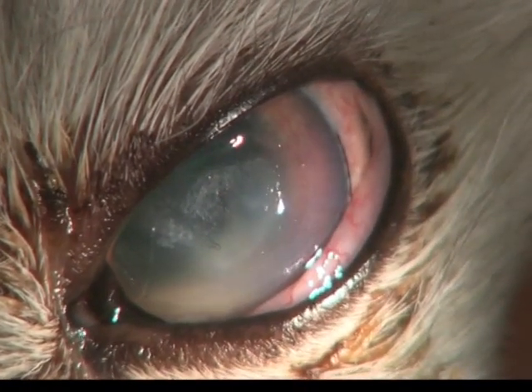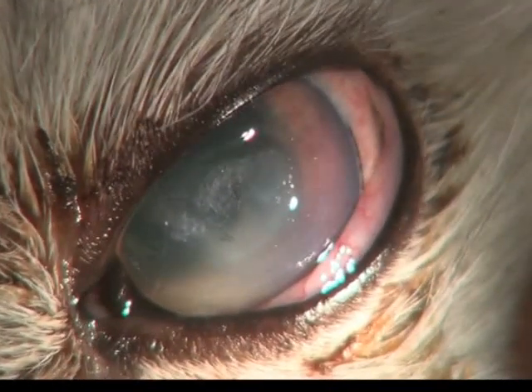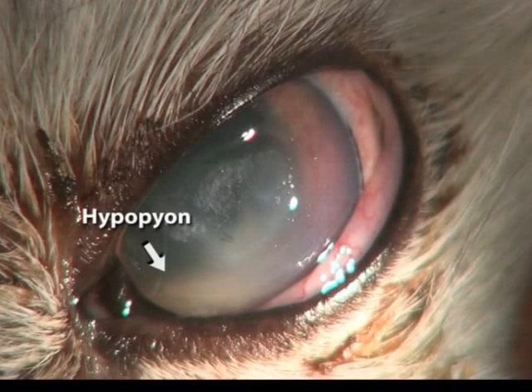Accumulation of inflammatory cells within the anterior chamber is known as hypopyon. Note that the cells often settle ventrally. In this case, uveitis was secondary to an infected corneal ulcer.